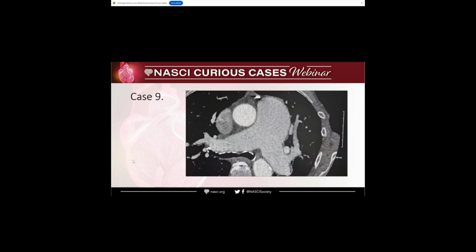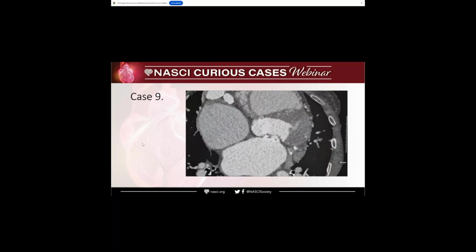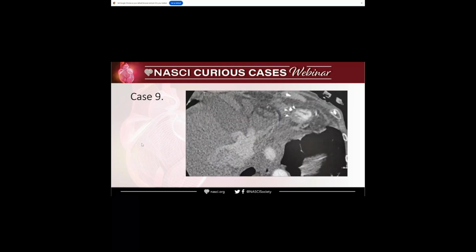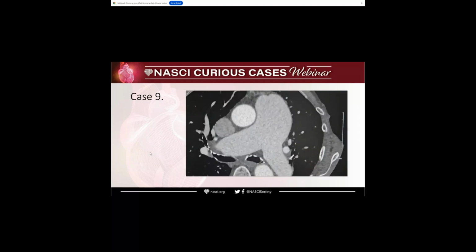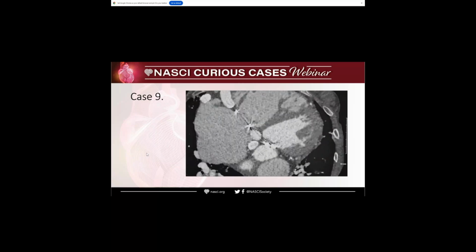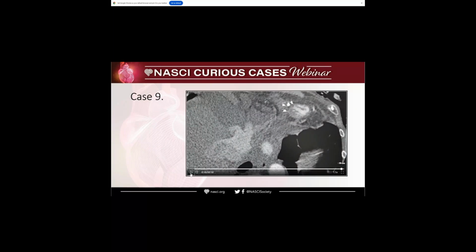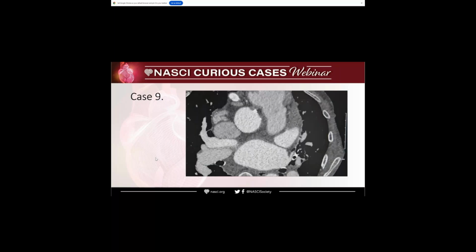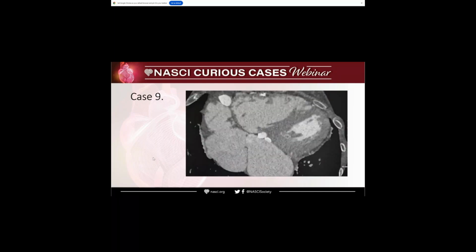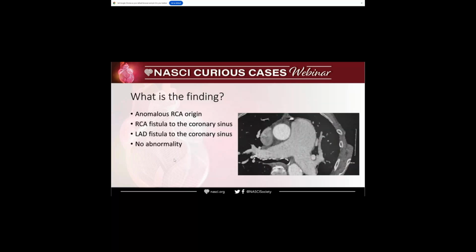We have another case. One more time. Okay, so what is the finding?